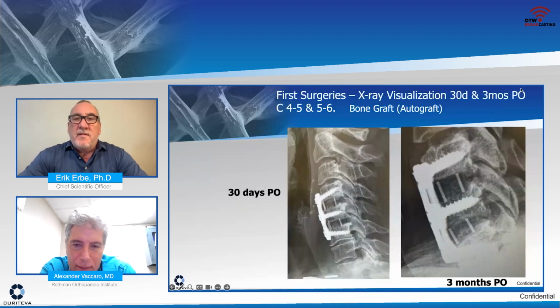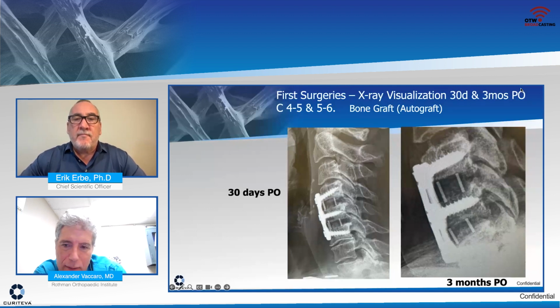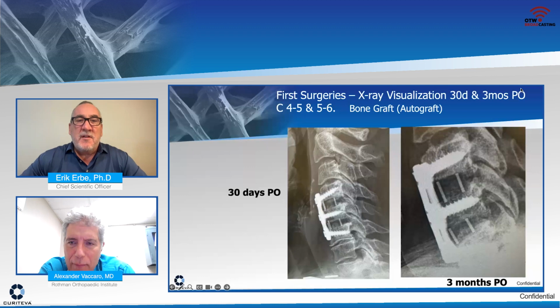And if you look at this slide again, a well-placed graft, you could see at the 3-month part, you start to see the ingrowth of the bone, you see the dissolution of the vertebral body end plate. In the picture on the left, you could see the end plates. In the picture on the right, you don't see the end plates as well, because now you're starting to get osteointegration with the implant itself and the filler. So well done, Kevin. Surgery looks great. You have maintenance of disc space height, and it looks like you're integrating the actual interbody spacer with the vertebral host bone.